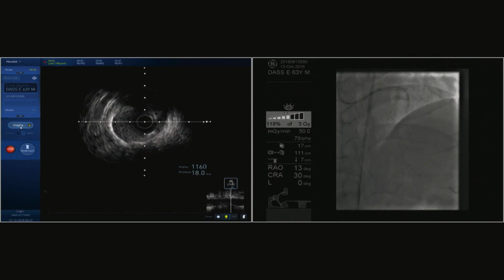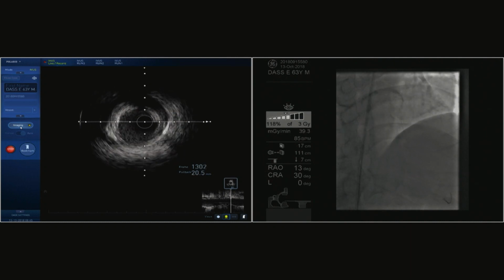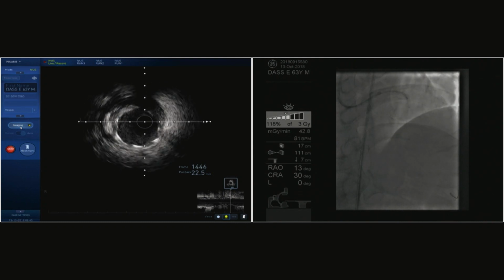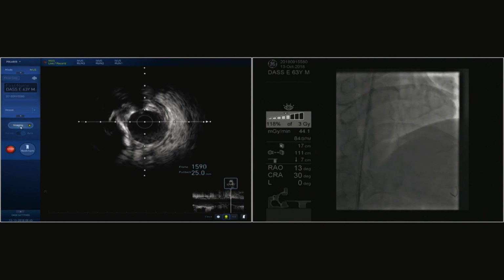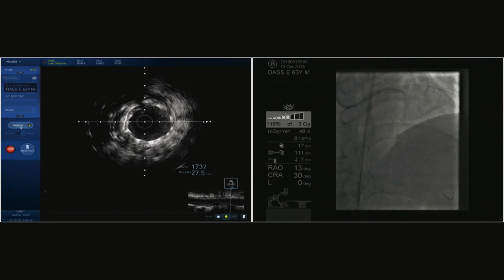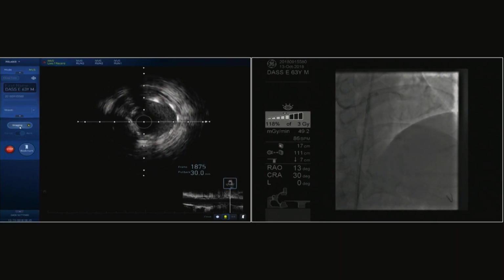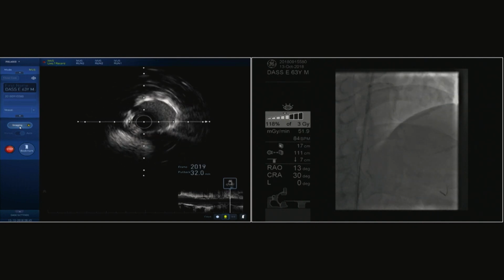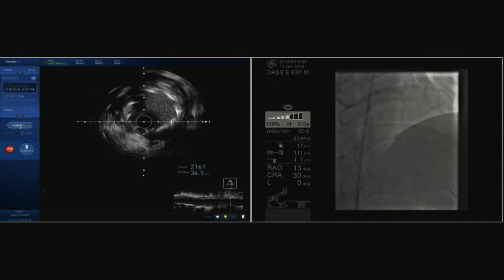But clearly in your labs, 14 atmospheres, 8 at 10 atmospheres is truly not adequate. It's normal for me in 95% of the patients to go to 20 atmospheres in these calcified lesions and up to 25 atmospheres with the non-compliant balloons. Because once you're optimally sized, you actually need to expand these and get the maximum lumen. So it's not just apposition, it's getting the maximum lumen in these calcified vessels. I would image after I've done an optimization in the way I think it should be done, rather than a stepwise, which is great for today's teaching.